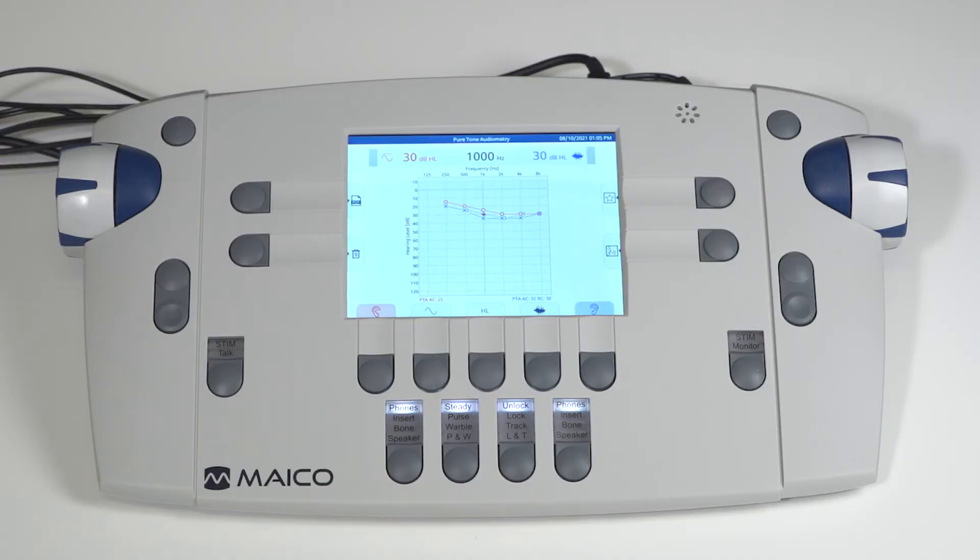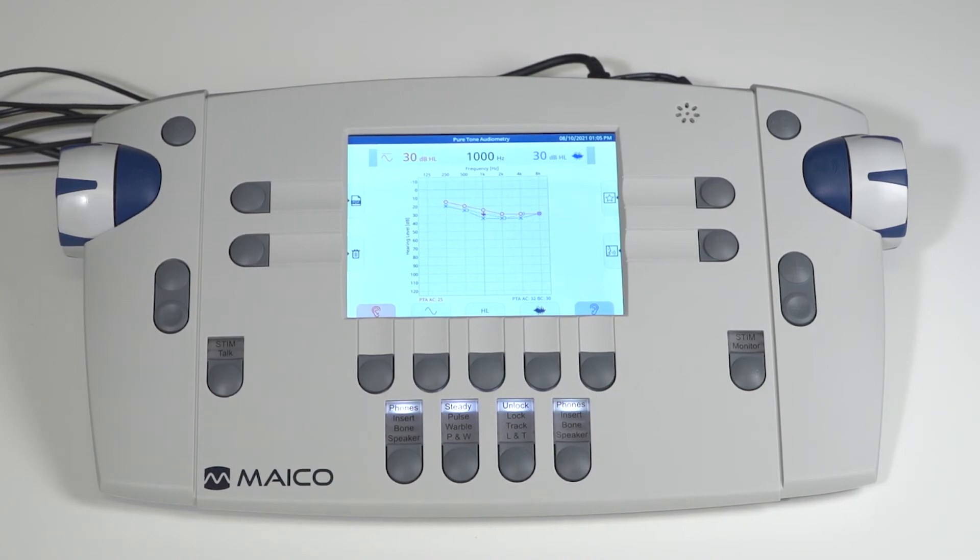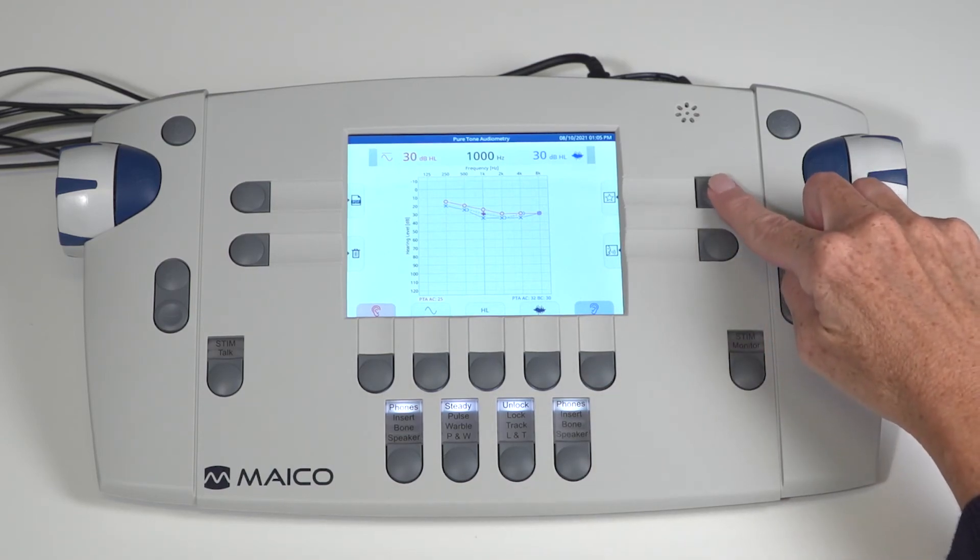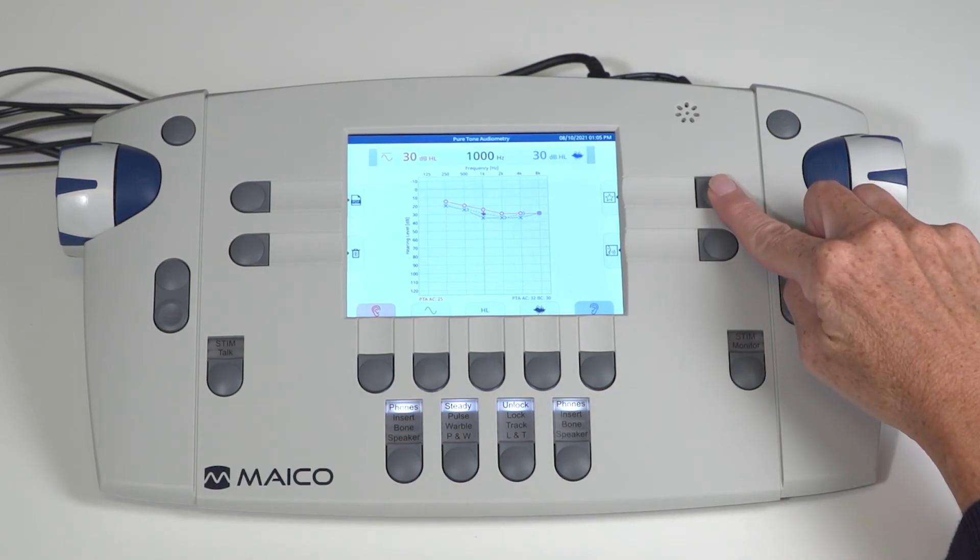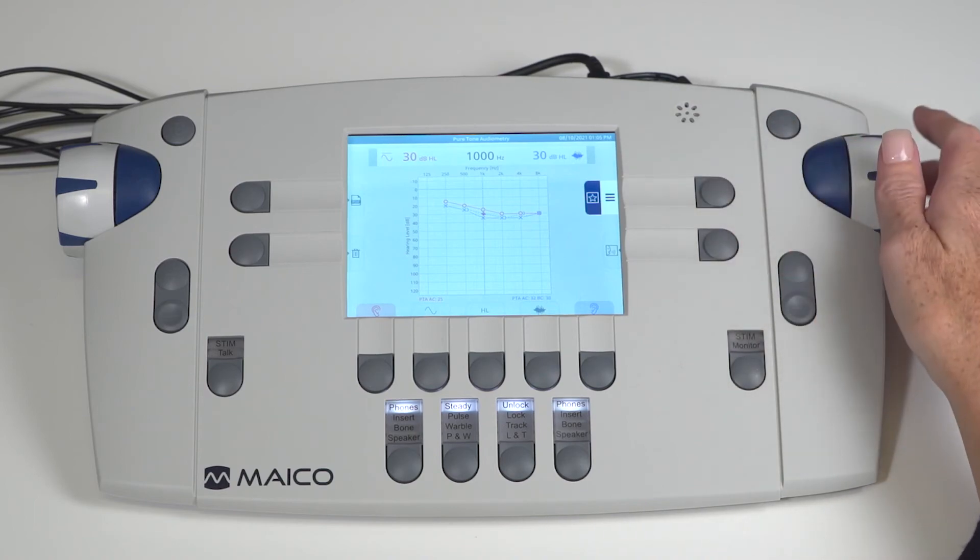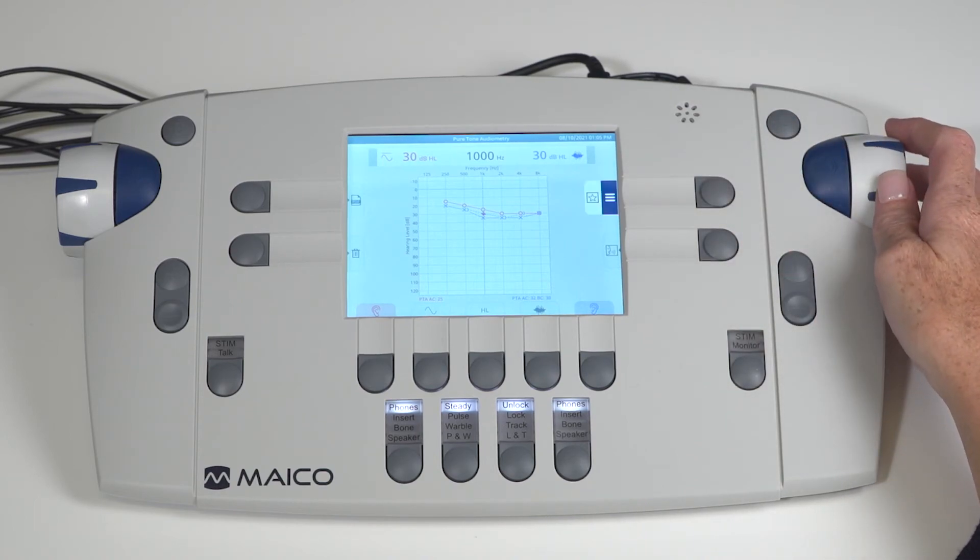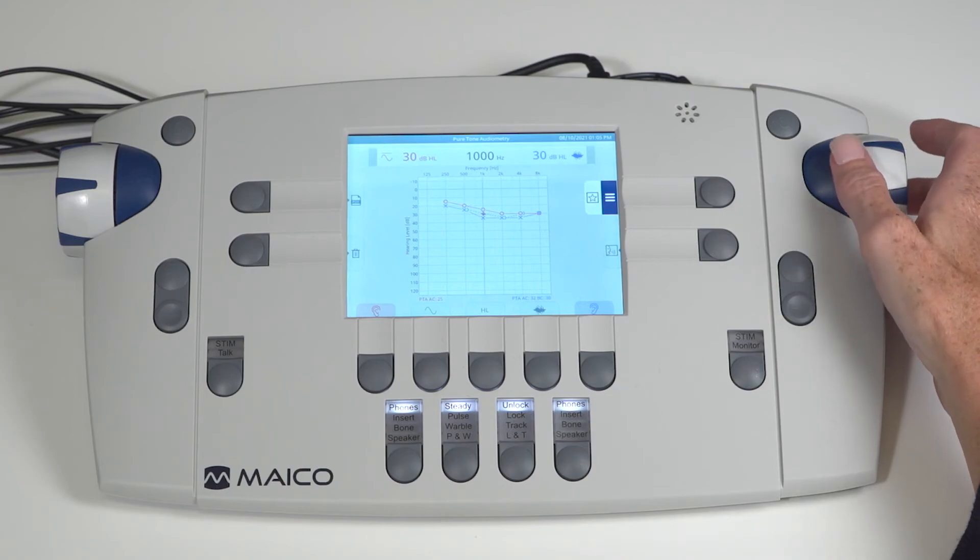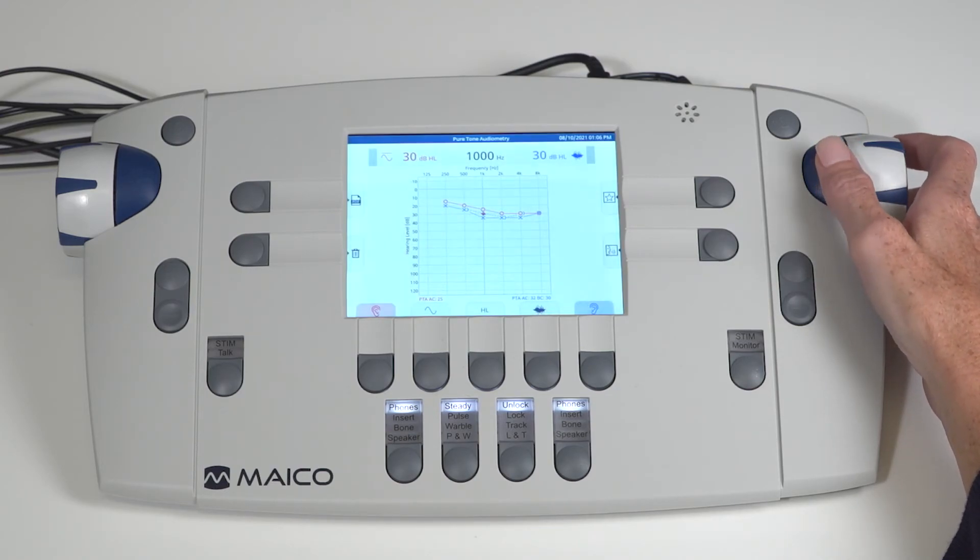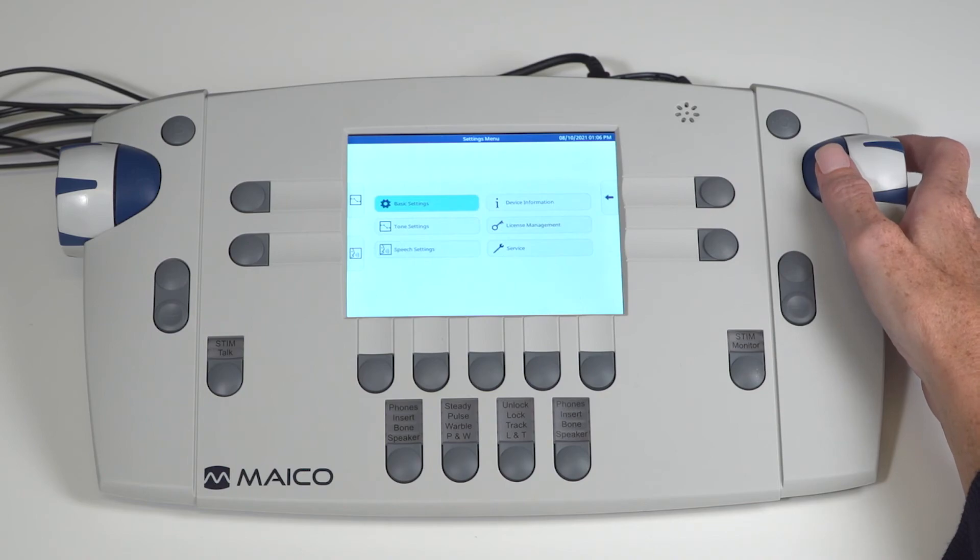The MA42 audiometer contains many setting options that allow you to customize your audiometer. Default settings have been chosen to accommodate the most common uses. However, if these default settings do not meet your needs, the settings are easily changed in the settings menu. Select settings menu from the top right display key. This is displayed with the advanced select function. Press and hold the key to expand the selection. Highlight the setting icon with the side dial. Then press the present key to make the selection.